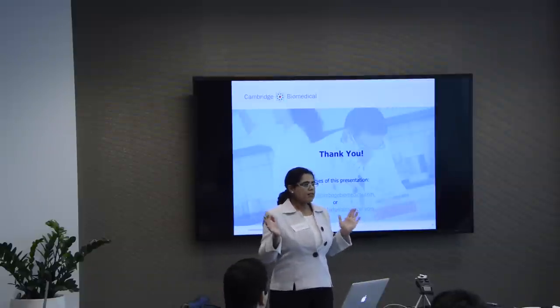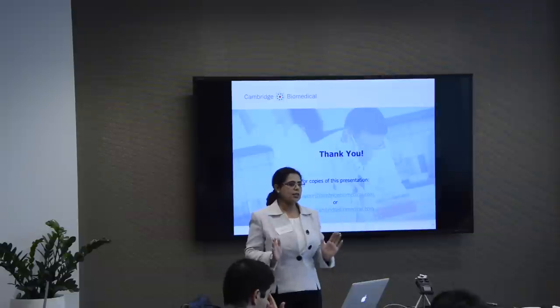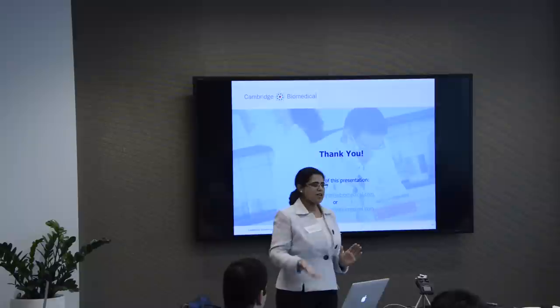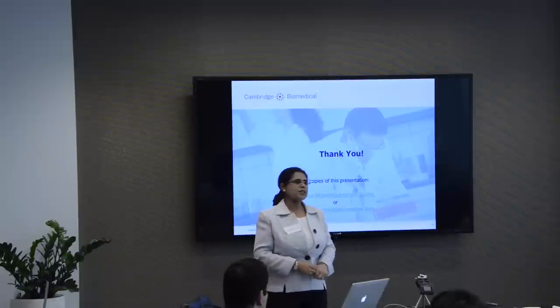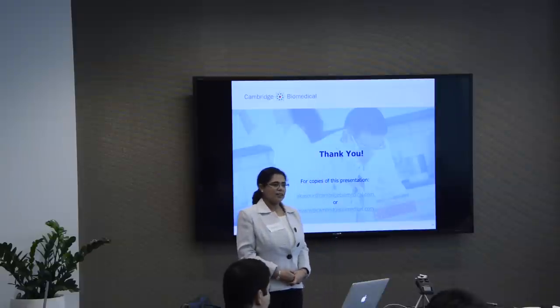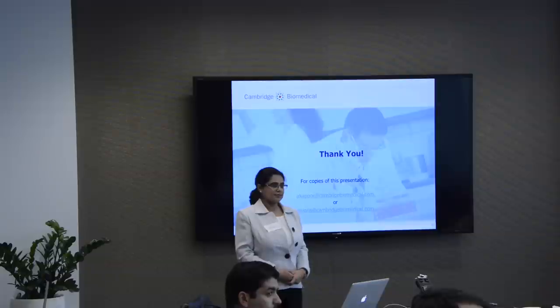But remember, everything has to be done once you validate. It has to be applied to the patient samples. Correct. How many patient samples are you going to apply that magic solution to? It has to be a standard procedure. Correct. Once the sample is collected, you'd have to send it out in a kit. So this would be something totally validated, provided as a kit to be incorporated as part of that particular assay kit, whether it's a commercial kit or something that you develop as an LDT. I'm asking because it's come up a lot.